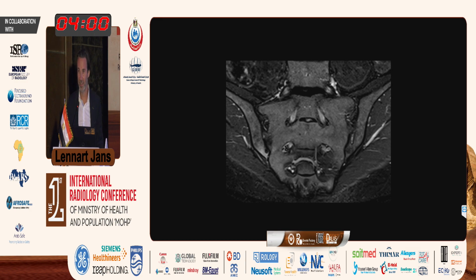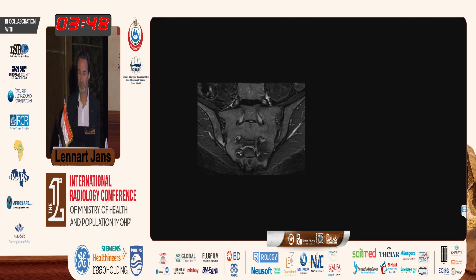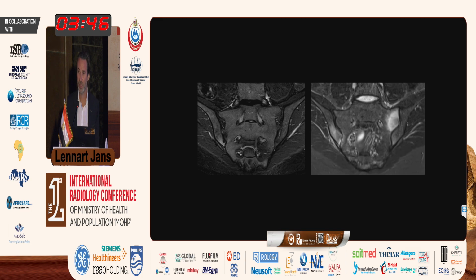Who thinks that they don't have it? Who thinks that it's just impossible to know from this single image? Now I see a few hands, so yes, indeed, I agree, right? So this is a patient that had a previous MR examination 6 months before.